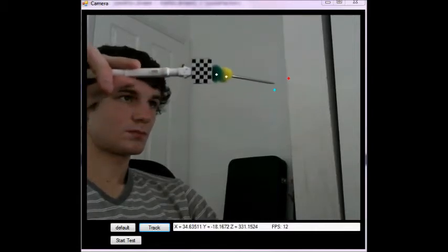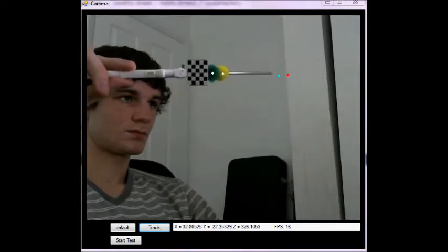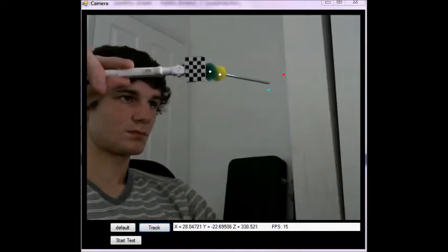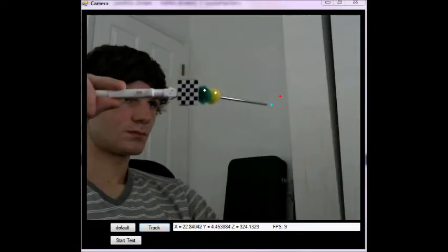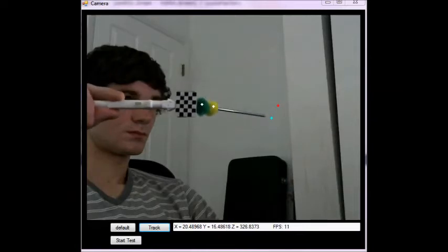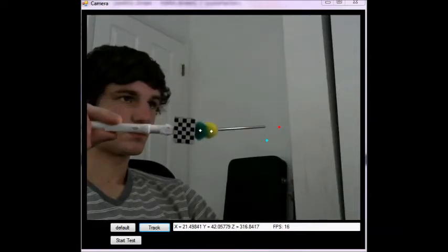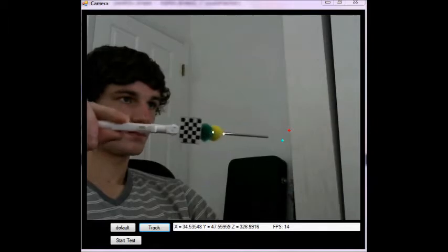An estimate of the z-axis, which is the distance away from the camera, can be taken from the checkerboard tracking method. The spheres produce no estimate for the z-axis, but as seen in the video, produce a better estimate than the checkerboard tracking for the x and y-axis.